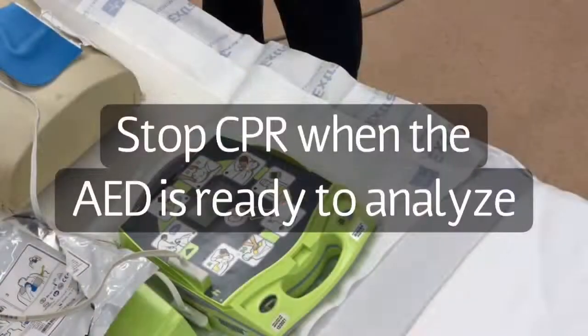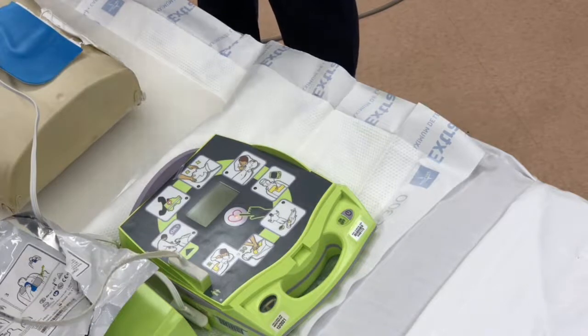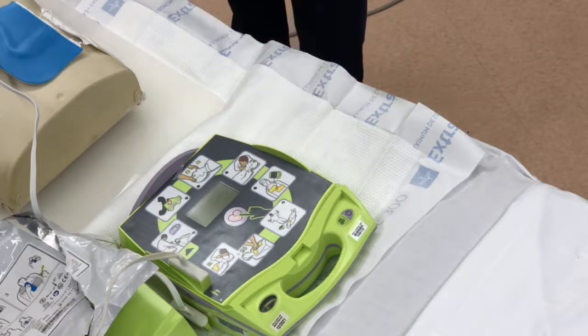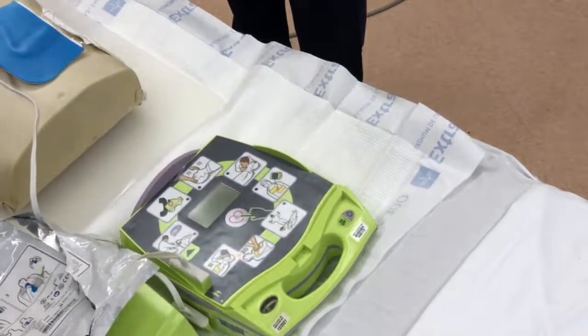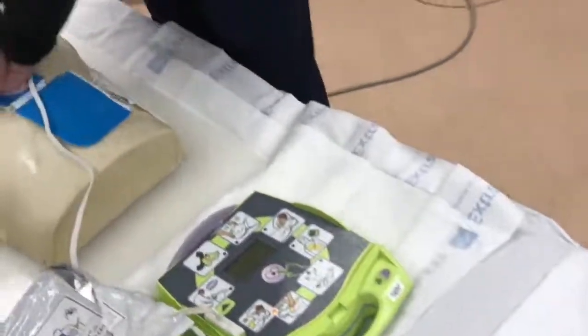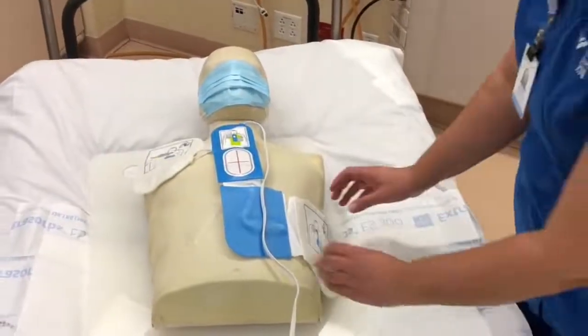Don't touch patient. Analyzing. Shock advised. Don't touch patient. Press flashing shock button. Shocking on 3, clear the patient. 1, 2, 3. Shock delivered. Resume CPR. Start compressions.